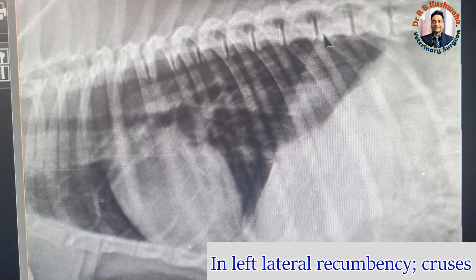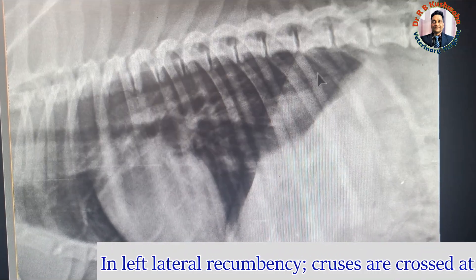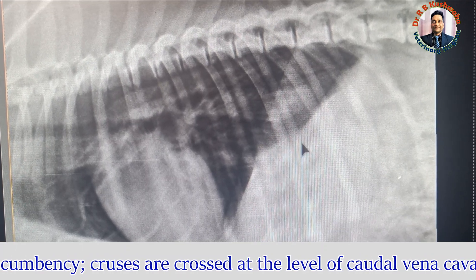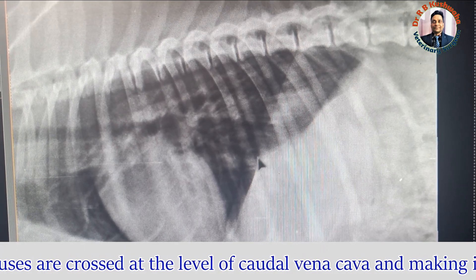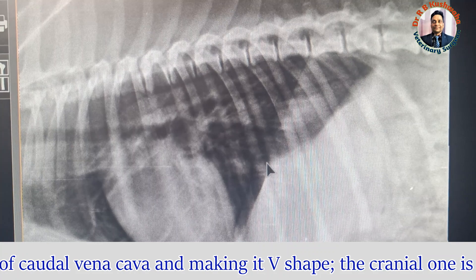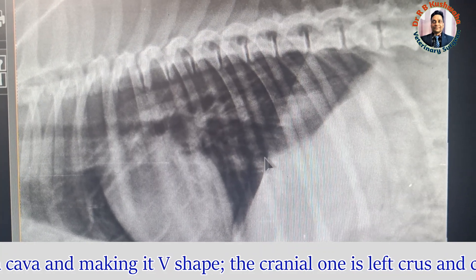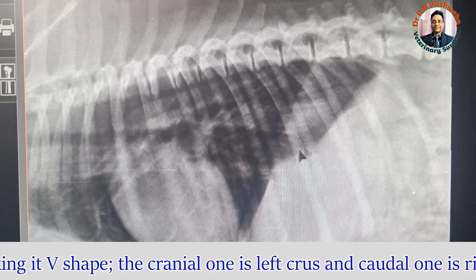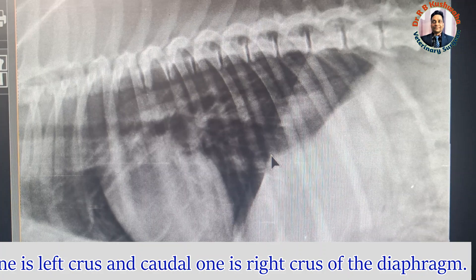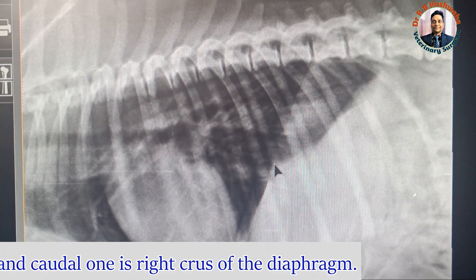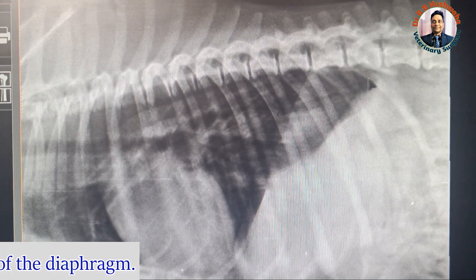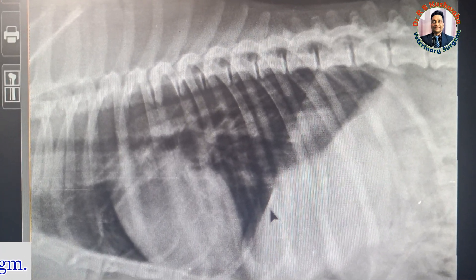This is the lateral radiograph of a dog. You can see here — this is one crus of the diaphragm and this is the other crus of the diaphragm. If the crura of the diaphragm cross at the level of the caudal vena cava, making a V-shape, that means this particular radiograph was taken in left lateral recumbency. In left lateral recumbency, the cranial one is the left crus of the diaphragm and the other is the right crus.